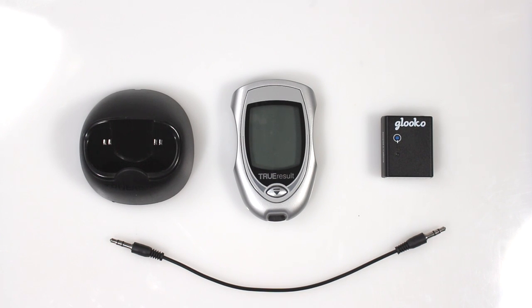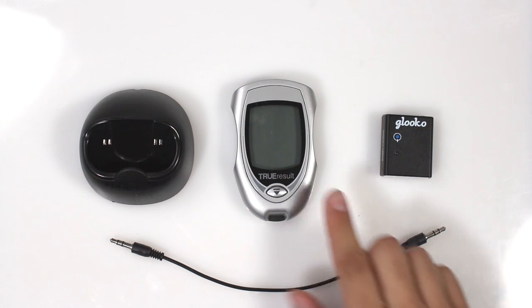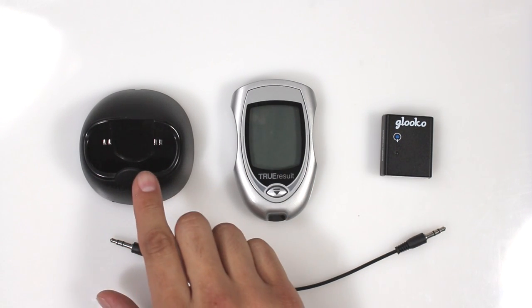Before you get started you are going to need the Meter Sync Blue, a 3.5 millimeter meter connector, and your TrueResult Meter along with the TrueResult Dock.